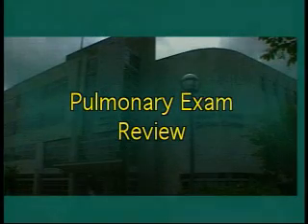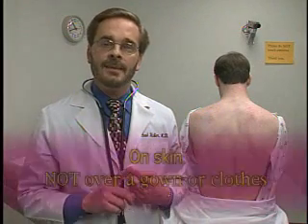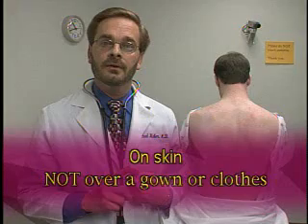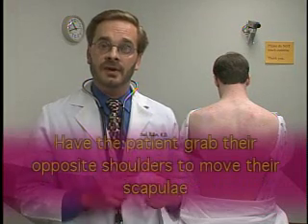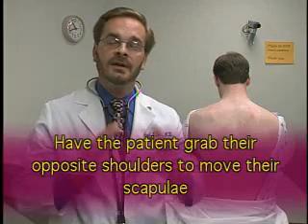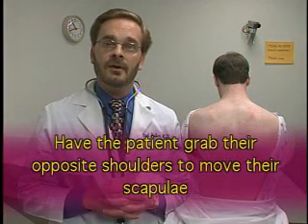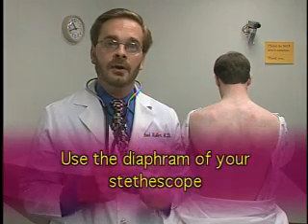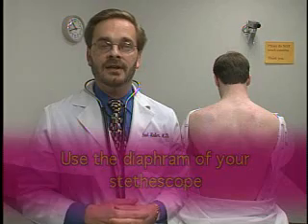Again, I'd just like to remind you of a few key points whenever you do the pulmonary exam. Number one, the examination is always done on skin. It's never done over an article of clothing or a gown. Number two, it helps to have the patient grab their shoulders to move their scapula laterally to increase the examinable area of the lung fields. Number three, we always use the diaphragm of our stethoscope when we're doing the pulmonary examination.